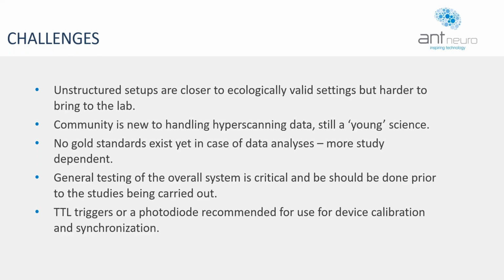Finally, when we have multiple devices that are to be synchronized and calibrated before they are run in parallel, we do recommend that a general test is done. It is in fact critical and should be done prior to the pilots being run, because this is the only way you can take into account fixed offsets that can be part of your hardware or part of your network infrastructure. Finally, hardware triggers or photodiodes are what we recommend using for device calibration and synchronization.